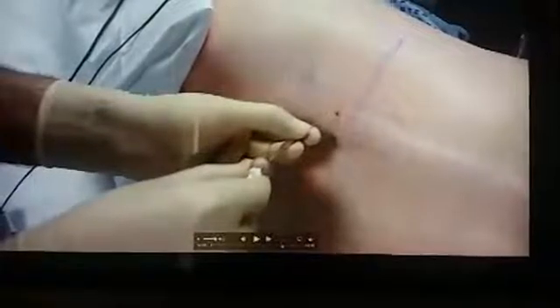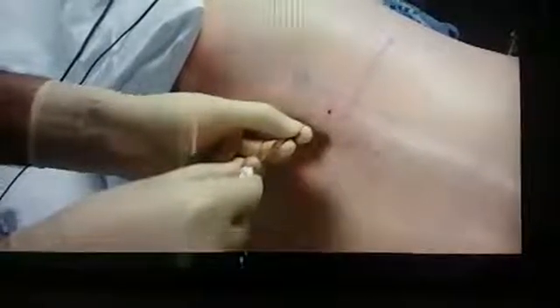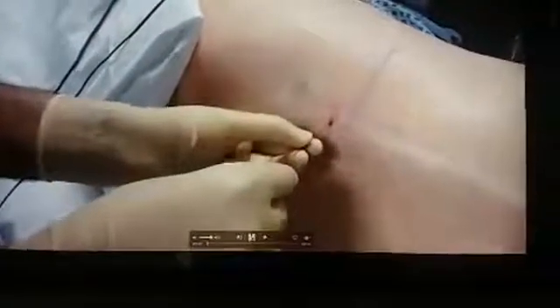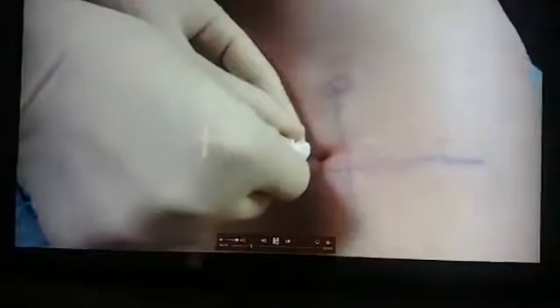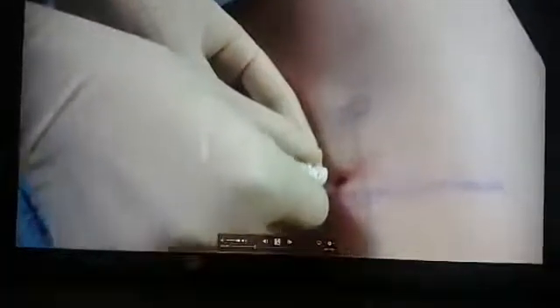A point just below or above that will be our mark where we'll go with the needle for the lumbar plexus block. You can see it's going at that point — about a centimeter below. We usually use either an 80 or 100 millimeter needle. As I've explained before, the aim is to hit the transverse process. You try to hit the transverse process and then walk off it cranially or caudally — wherever you find it easier. That's hitting the transverse process at around 80 millimeters or eight centimeters, and then you start trying to walk off and look for the quadriceps response.